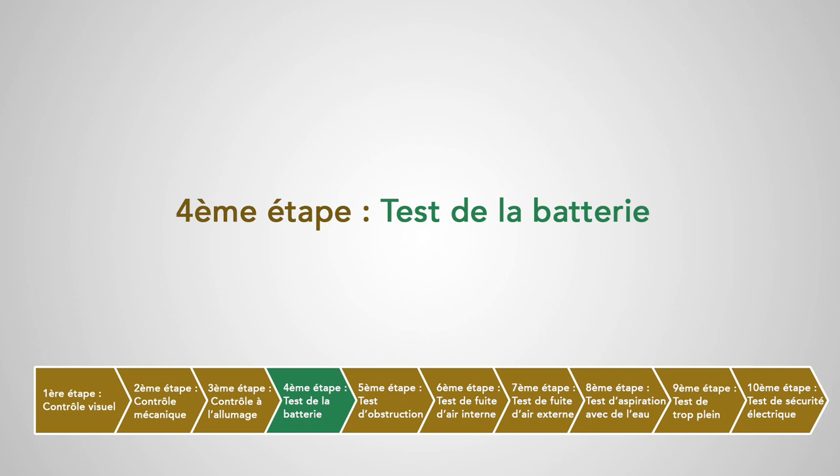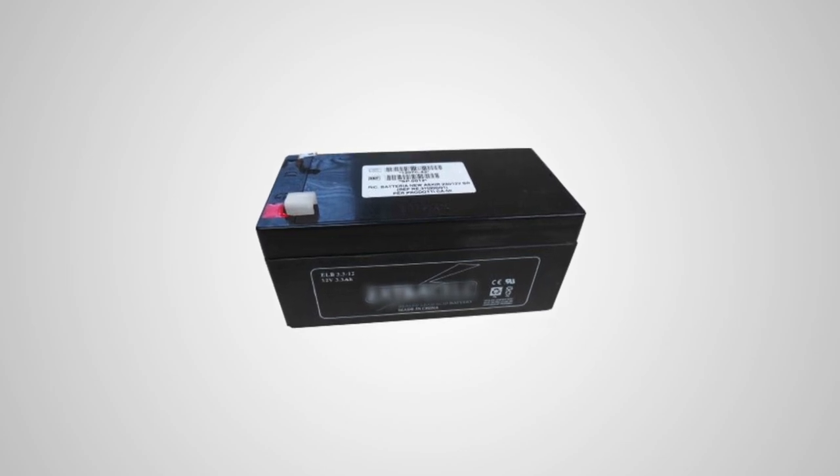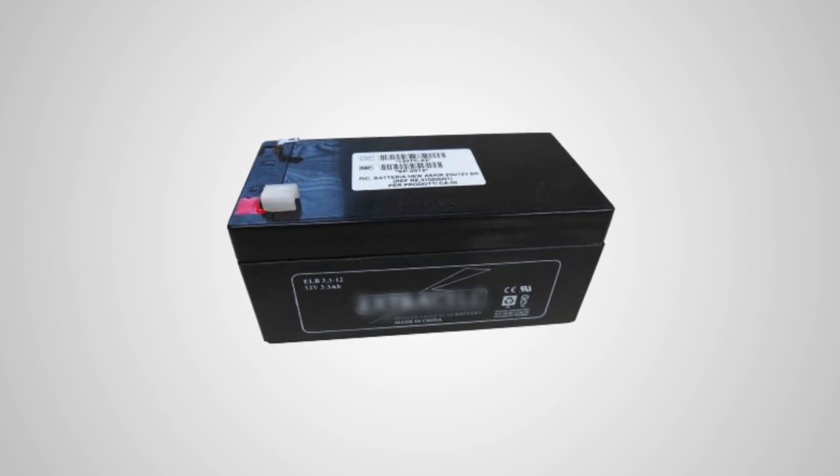Quatrième étape : test de la batterie. Si l'appareil est doté d'une batterie, recharger-la au maximum et vérifier que l'appareil peut rester en fonctionnement au moins 20 minutes sur batterie.